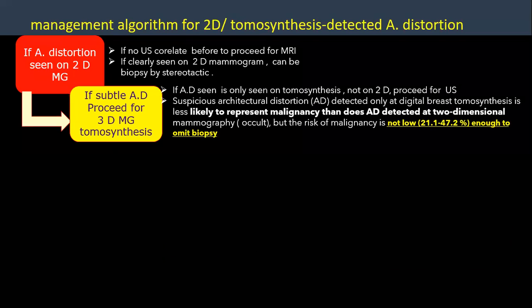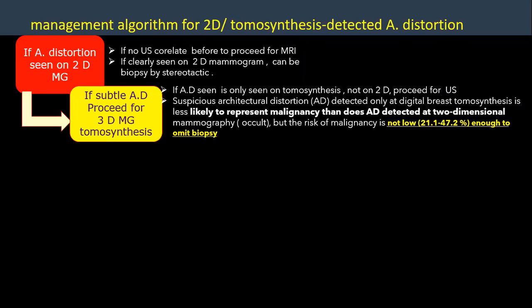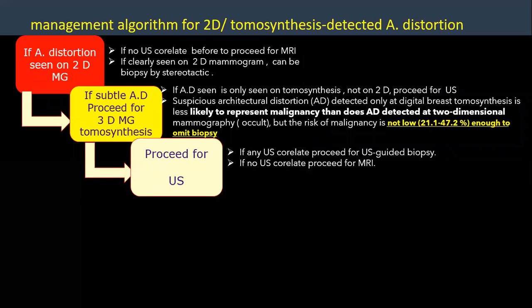If you don't have it, proceed directly to ultrasound. And if you have done the tomosynthesis and proved the architectural distortion, also proceed to ultrasound.